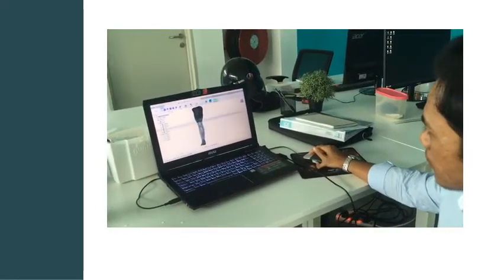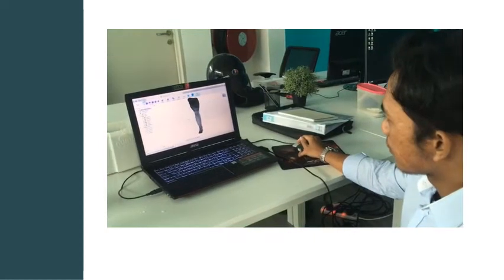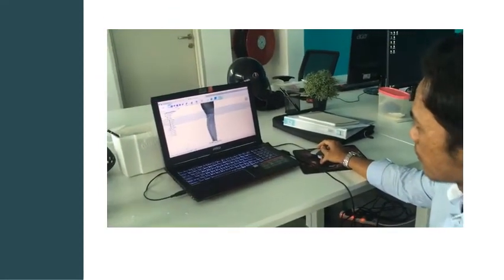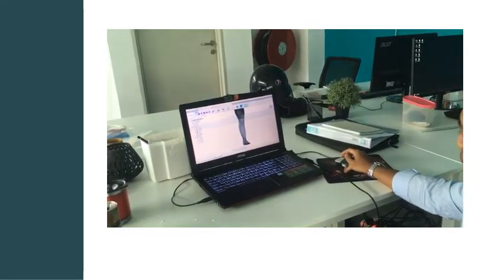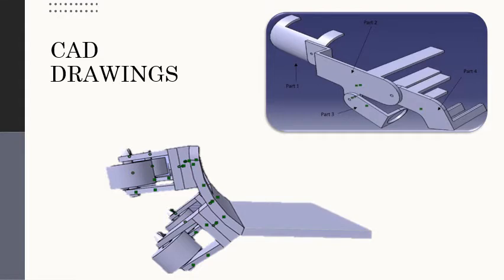This is an example of the designing process of the AED using CATIA and CAD software. Note how amenable and conformable the design can be to conform to the patient's unique anatomical shapes and landmarks. This is an example of CAD drawings of the developed AED that is ready for printing. Note the mechanical features that can be integrated in the design that cannot be developed by conventional methods.